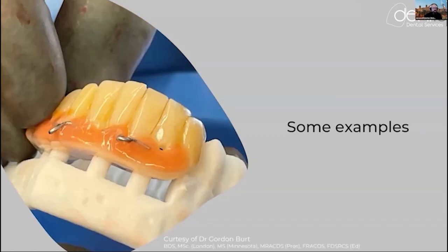Also, what I would love, this one is actually from one of the clinicians I work with. I'm really proud to work with and know this dentist. This is for a patient who had a jaw cancer. So they removed part of the jaw, took some parts of the bone out of their legs, put that in and put this bridge on it, and those claspers to hold everything in place. This stays long-term in the mouth until everything is healed and they can replace the restoration. And it's absolutely amazing to see what is possible now with new materials.